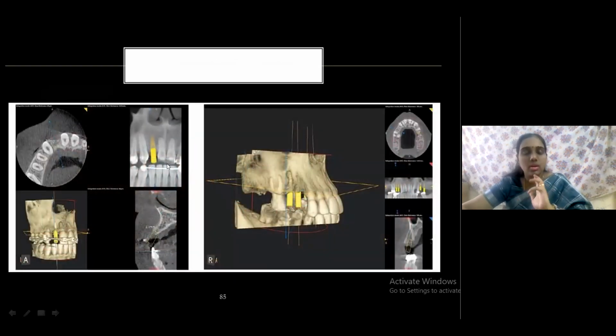Of course, this is an example of virtual implant placement. If a dentist needs to place a virtual implant, for example a Paltop or whatever company you have, the software has all the implant types from all the companies, with the particular width and length.